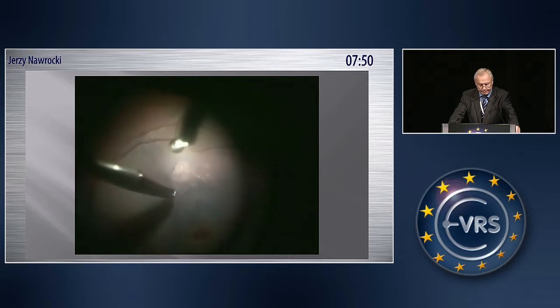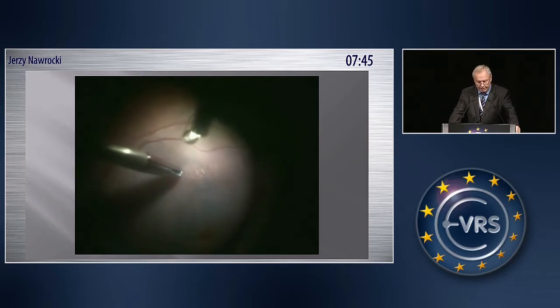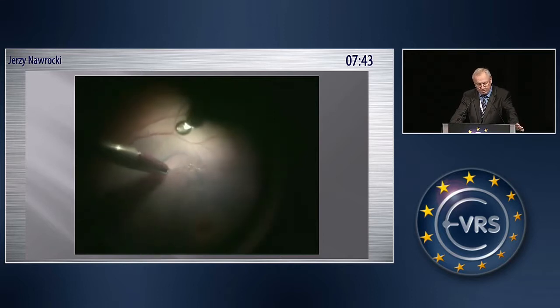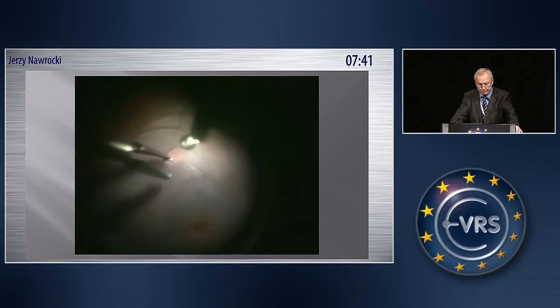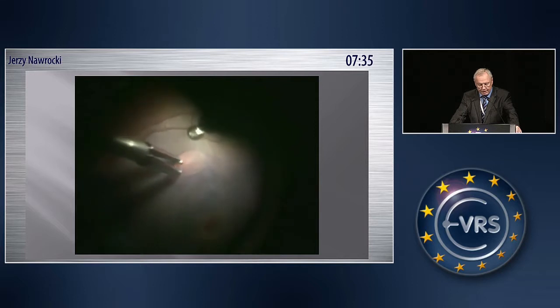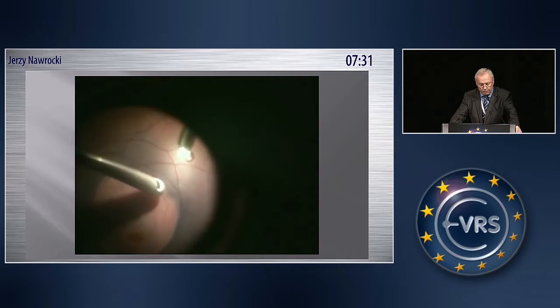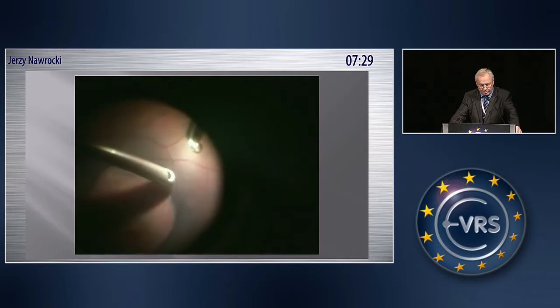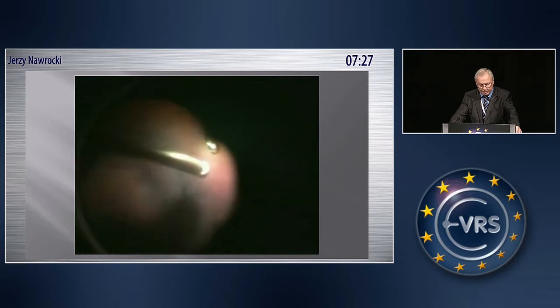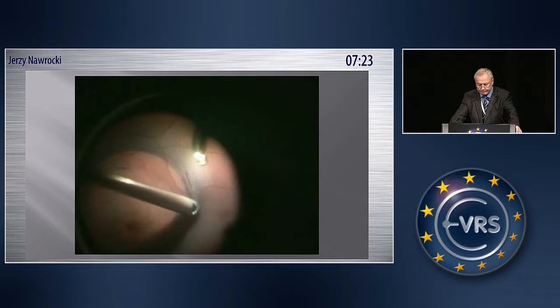ILM. And when I tried different instruments, it was maybe 2004 or so, and finally I peeled a piece of ILM around the macular hole, and this helped me to peel or to remove the posterior hyaloid. You see it here better on this part of the video. This is posterior hyaloid detachment.